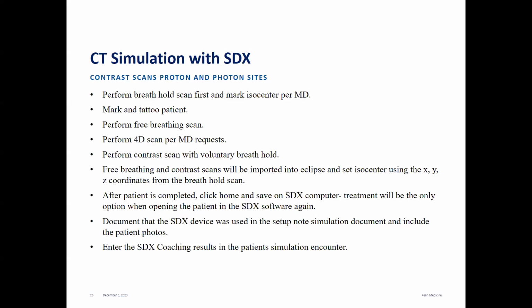After the patient is completed, you want to make sure that you click home and save on the SDX computer to make sure all of their information gets saved into the software so that nothing gets lost. You do want to document the device just like before and include any photos that would be helpful.